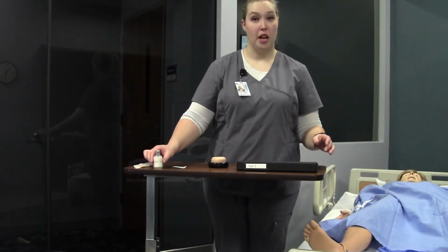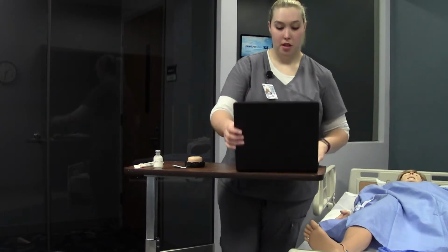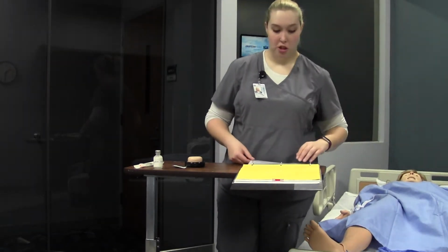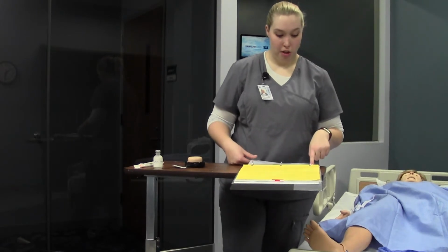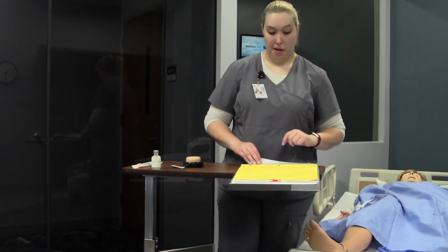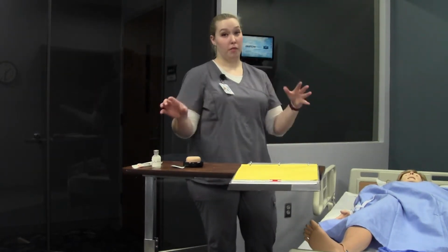I'll be demonstrating IM injections. So of course you need to grab your MAR and make sure that it's the correct patient. Make sure your medication's due. I have morphine 1 to 2 milligrams IM every 6 hours. I'm going to make sure that it's the appropriate time to give it, and it's the correct patient, correct medication, doing all of my checks.